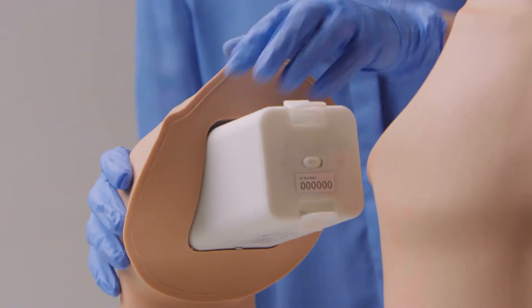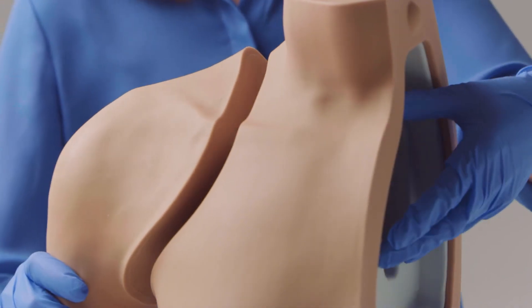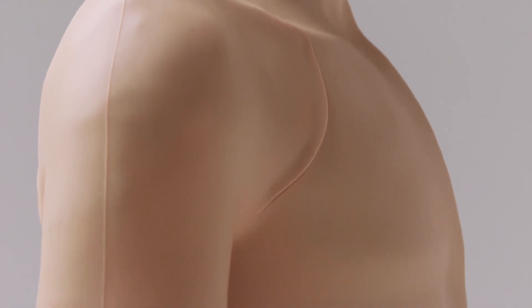Care and maintenance of the model is minimal. Each model comes with two skins, which can withstand up to 500 injections per site and are replaceable, making this a cost-effective training solution.